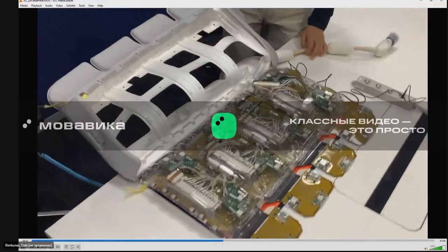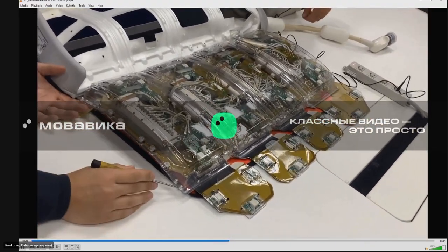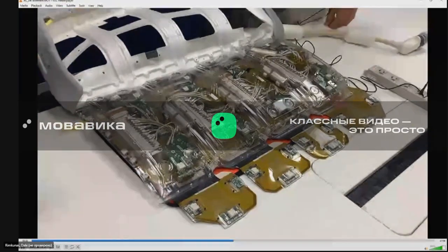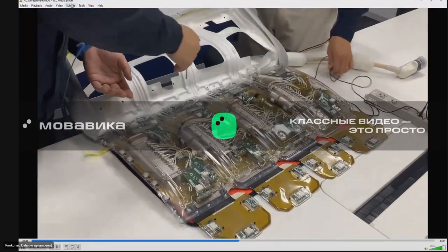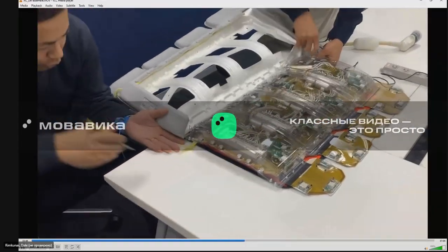Now, the next thing you have to do is detach all the pins. Push pin. You can see right there. But to make it easier, we already detached 40 plus of the pins, so we only have 10 of the pins left. So take a look.